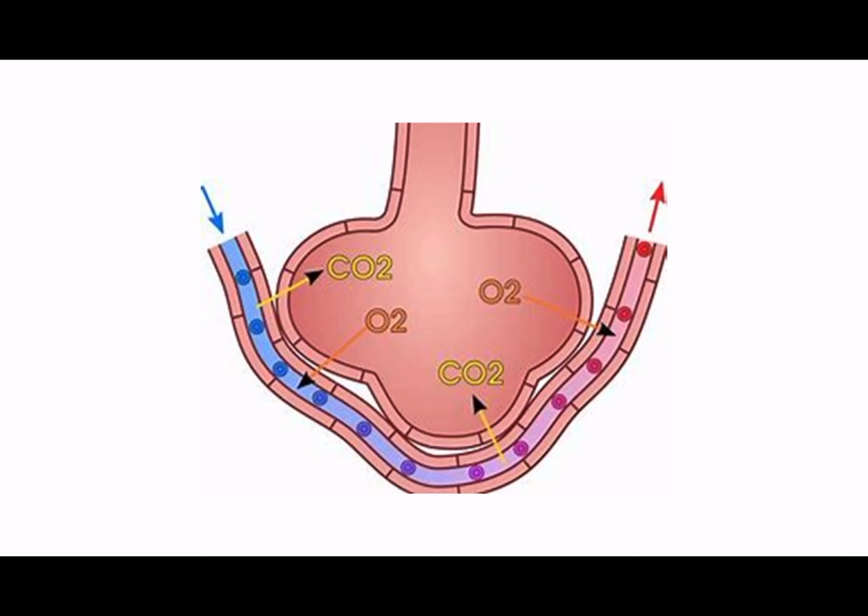This picture is the one picture that I want you to always bear in mind when managing a patient who's hypoxic or hypercapnic. It explains everything that we need to do for a patient in order to maximize and optimize their ventilation and oxygenation. The first thing to think about is having the alveolus open. The longer the alveolus is open for, the more oxygen diffusion there will be into the bloodstream.